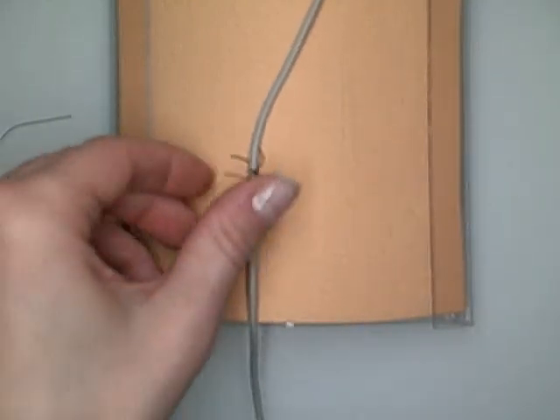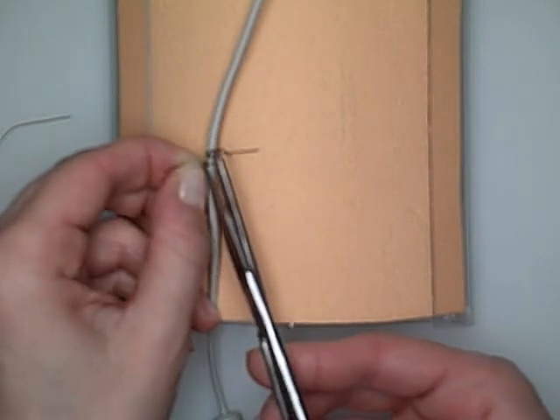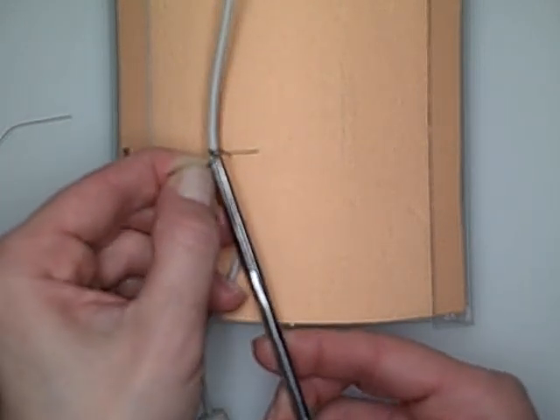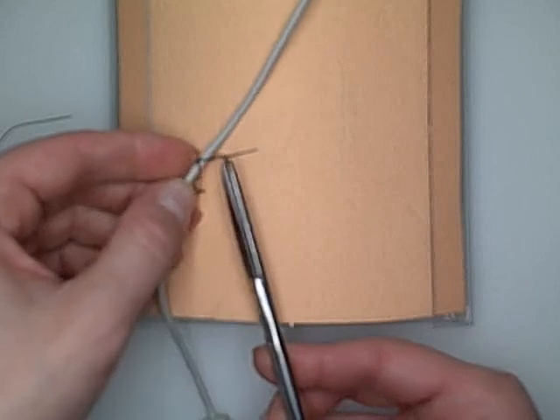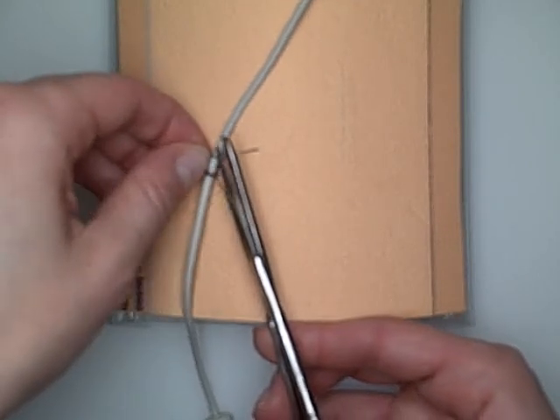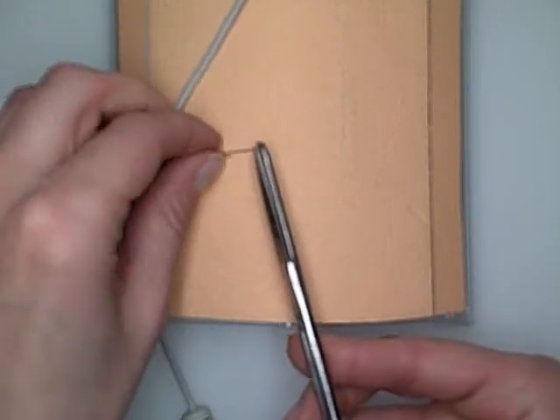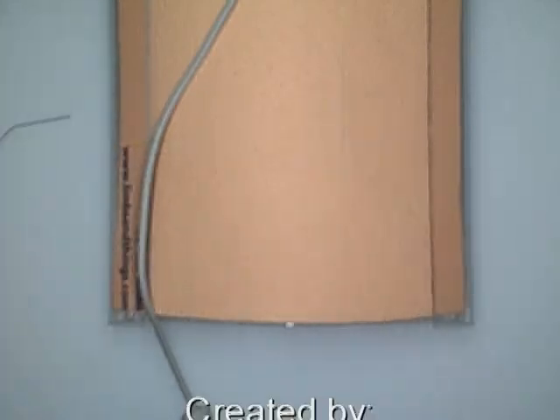When you're cutting this out, remember you have a few knots here, so you want to cut right close to the edge of the knot. We've got one more over here, and then one more over here. There you go.